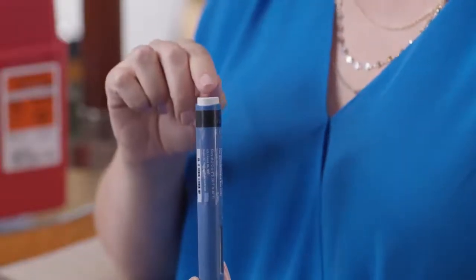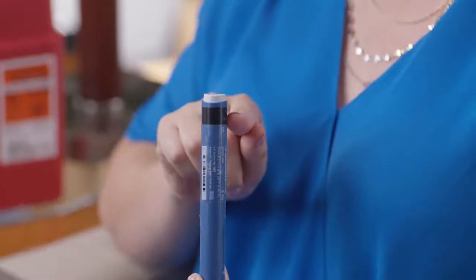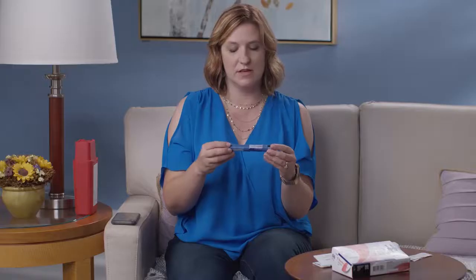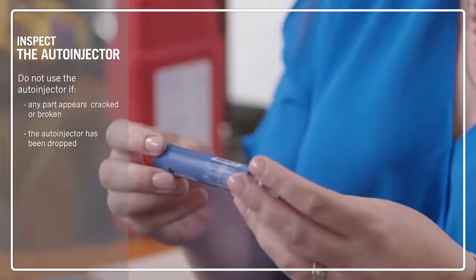This is the gray start button. This is the expiration date. This is the window where you can see the medicine. This is the bottom with the orange cap covering the yellow needle guard. Make sure that the cap is secure. Then take a look at the auto-injector for any cracks or breaks.